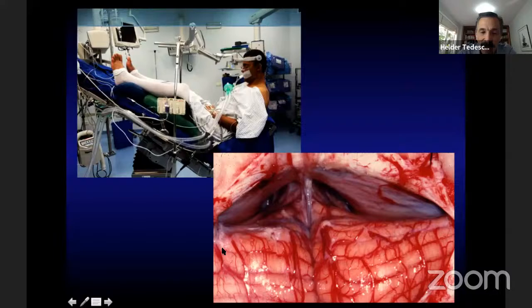If you make a craniotomy that is too small, there's no place for you to release CSF prior to anything. And the bone will sustain the cerebellum and you have to place much more retraction on top. So I usually either open wide or go all the way down to find a place to drain CSF at the cisterna magna when I want to go this way. Another criticism that I have on going lateral is that if you place retraction here and you have damage to either of the bridging veins here, it's very difficult to control if you don't have them exposed. So in my opinion, I've used the lateral supracerebellar a few times.